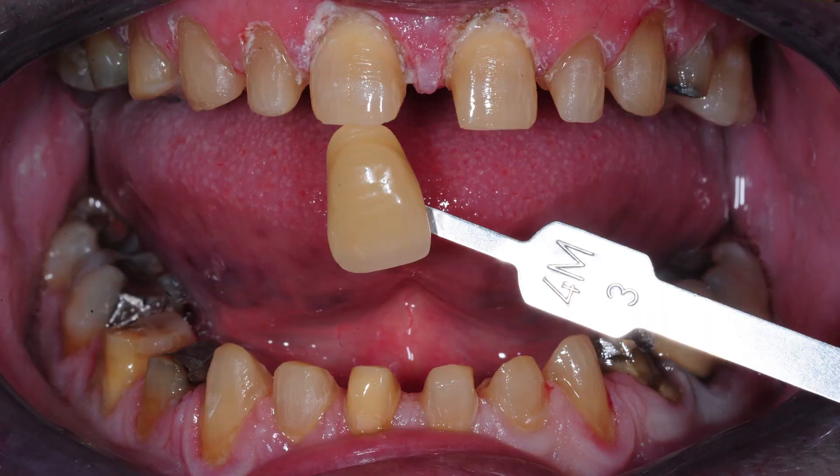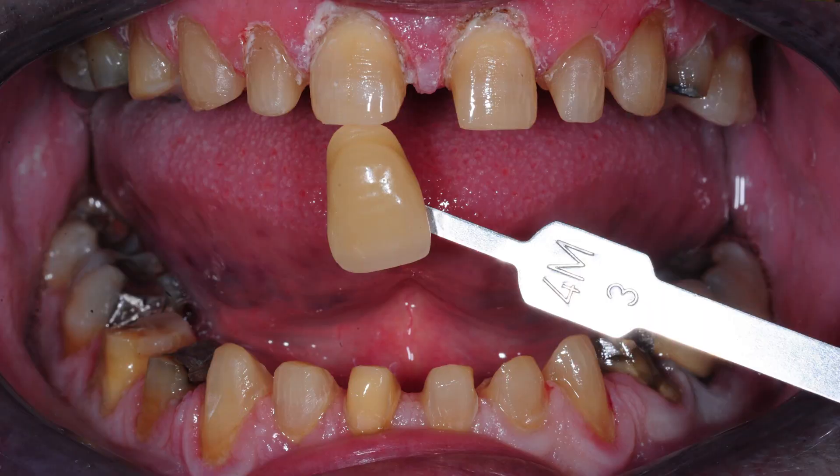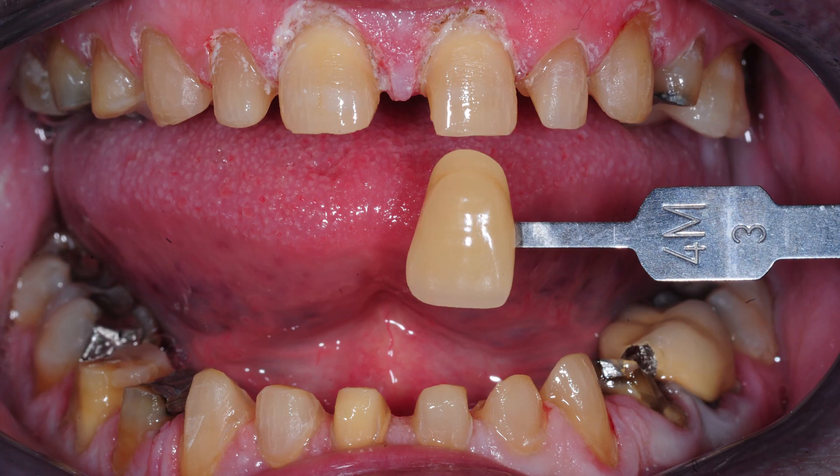What we have to have is a way that the laboratory knows exactly what that prep shade color is and the adjacent teeth.